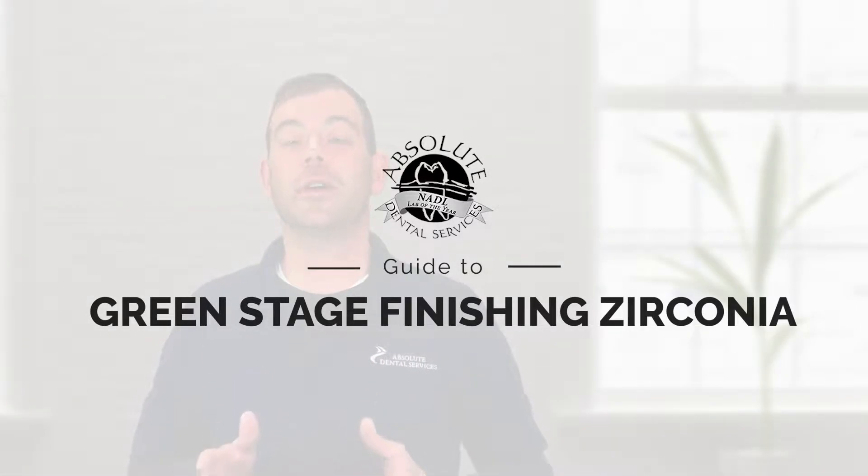After all these years, still the number one question I'm asked all the time is green stage finishing of zirconia. In this video, which actually played for Lab Day Fall Online, I'm going to basically show my techniques to green stage finish zirconia and the tools and instruments I use to do it. Hope you enjoy.